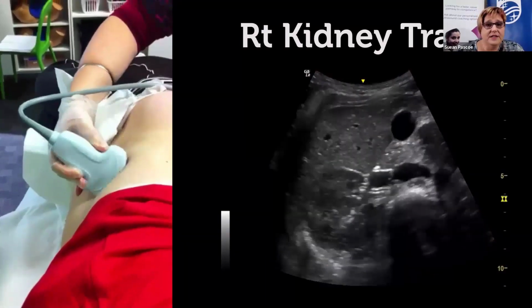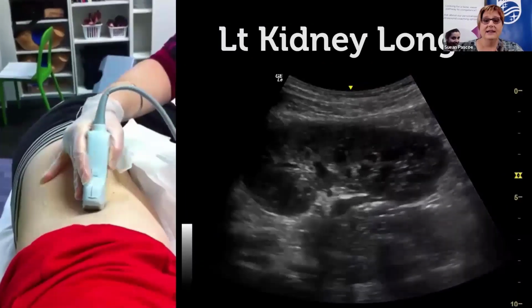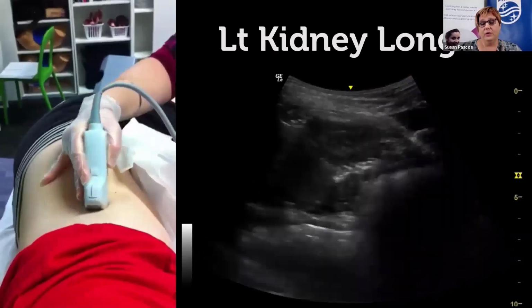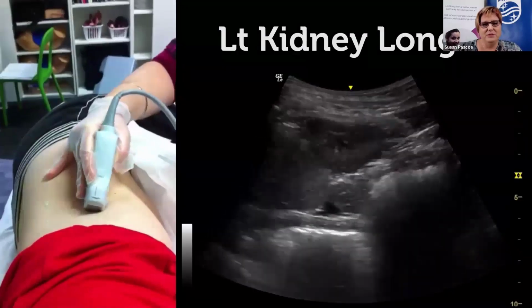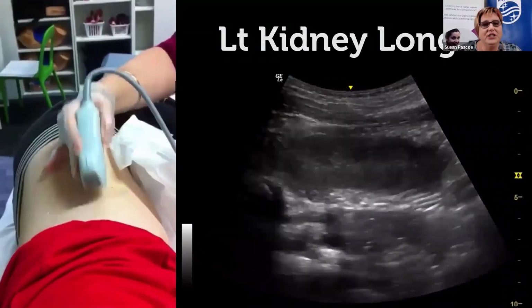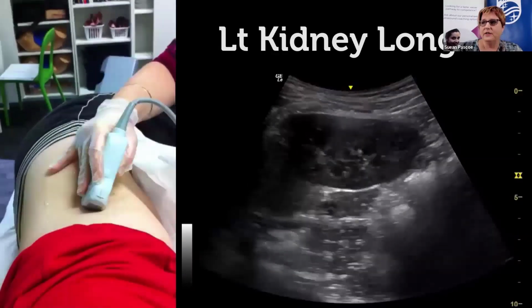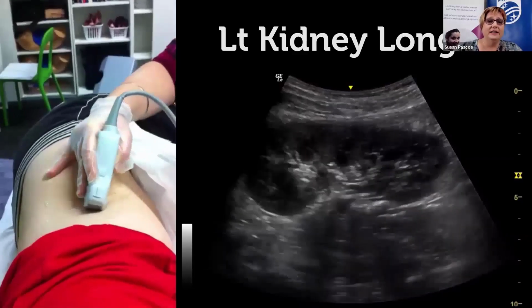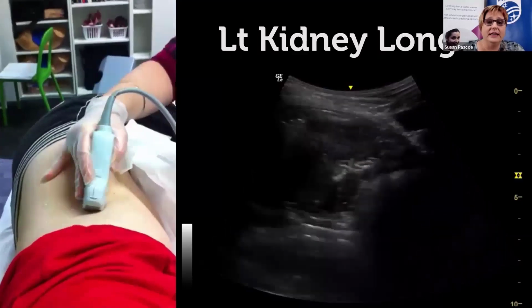When we scan on the left side, we roll the patient the other way, and again, this gives us good access. The tricky thing here is that you don't have a liver which occupies as much space. So the left kidney is often a little bit higher in the abdomen and a little bit more challenging to get the nice pictures. So you do need to work with what you've got, figure out where your spleen is, either use that as the window or come around a little bit more posteriorly to get a nice window for the kidney.